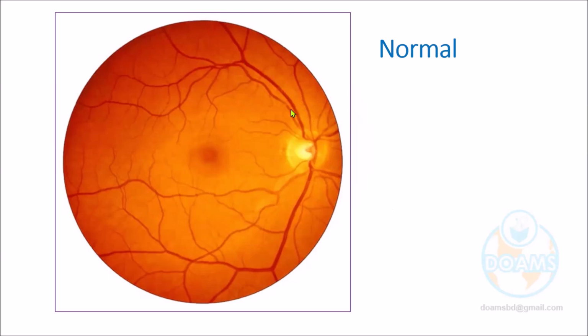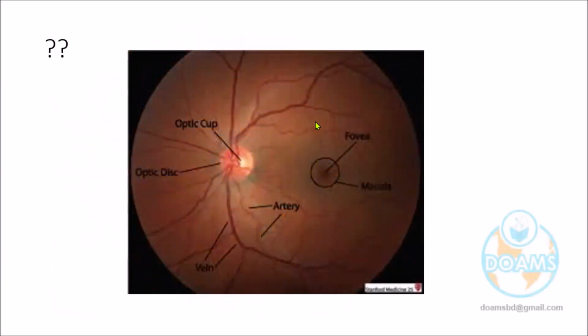And the name of the vessel? Retinal vein. But there's a name of this branch. Central retinal artery and vein. No, doctor, the central retinal artery is within the optic nerve there, not here. But this is the retinal vein. These are the branches. Which bigger one is vein or artery? A bigger one is vein. Yes. The narrower one is the artery. So it's a temporal arcade, superior temporal arcade, and below is the inferior temporal arcade. Okay, let's go further. Is it a normal retina?